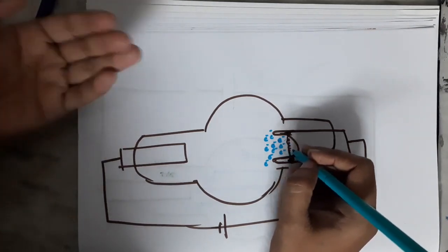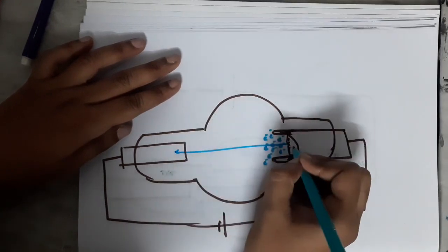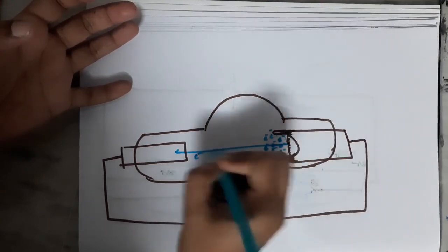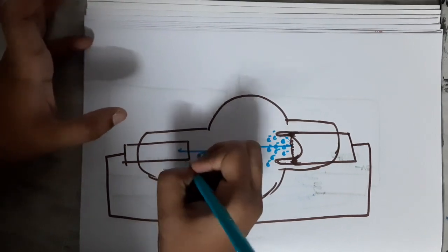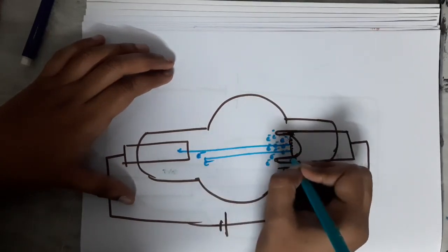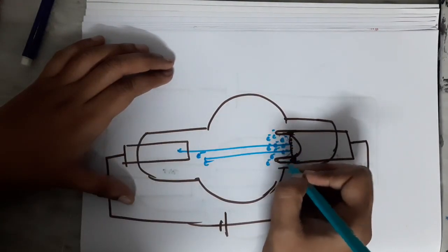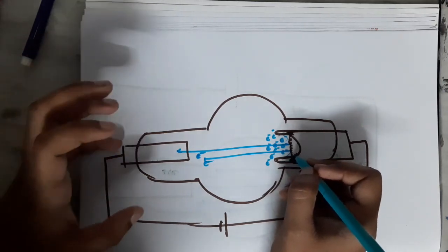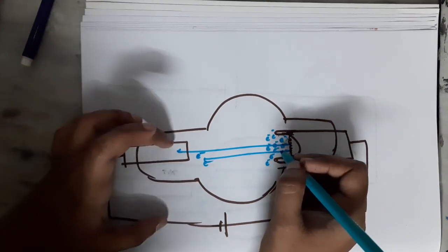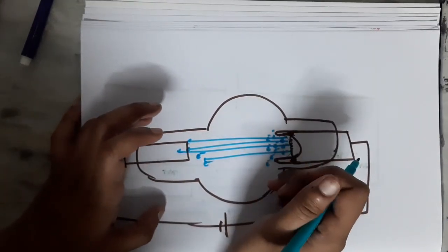Now the filament starts to get heated more and more, and one of the electrons from this filament will acquire a sufficient amount of energy to overcome the space charge, the negative charge, and it will go towards the anode, right? So here one more electron is going like this. Even if one more electron has got sufficient energy, it will not go at all, because of this focusing cup. The focusing cup is surrounding the filament, and it will only allow the electrons to go in one direction and prevent them from going in other directions.